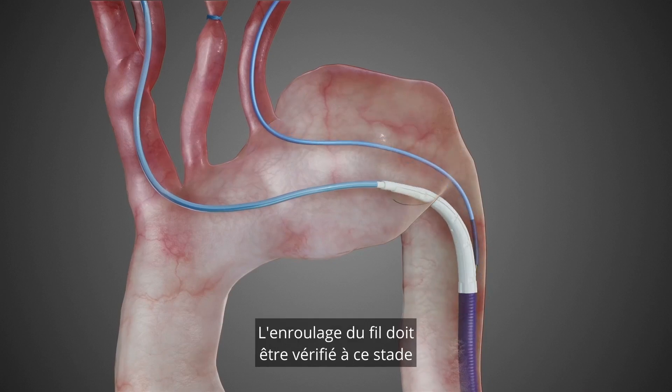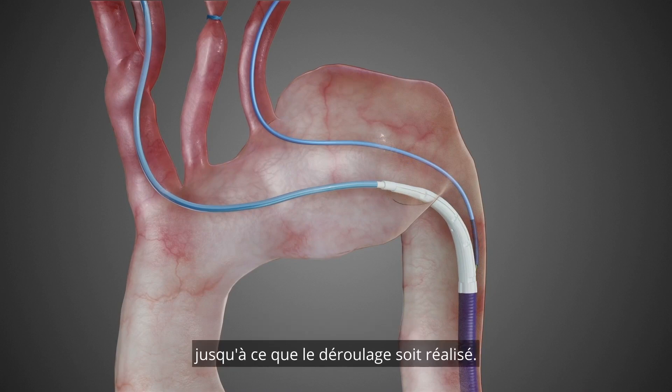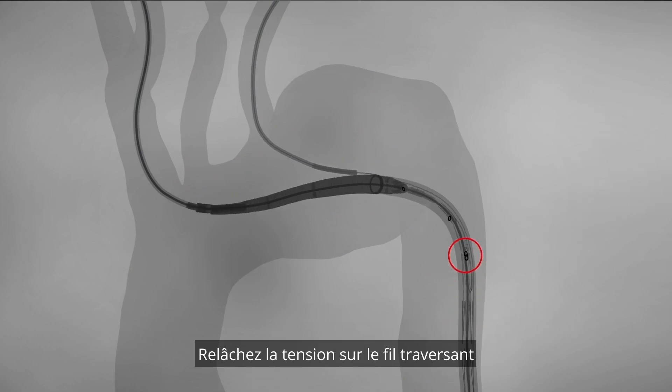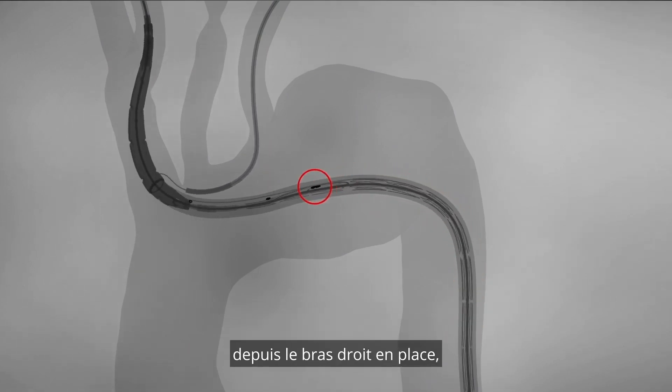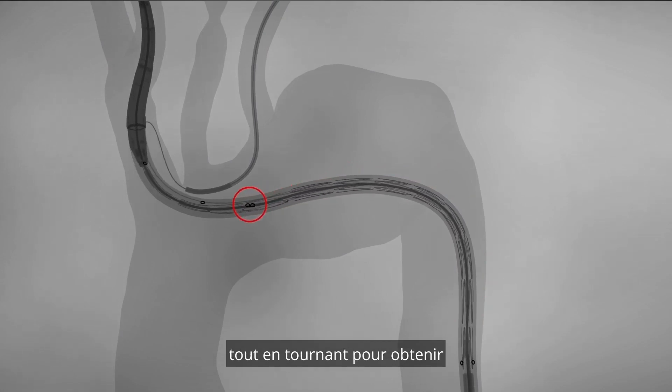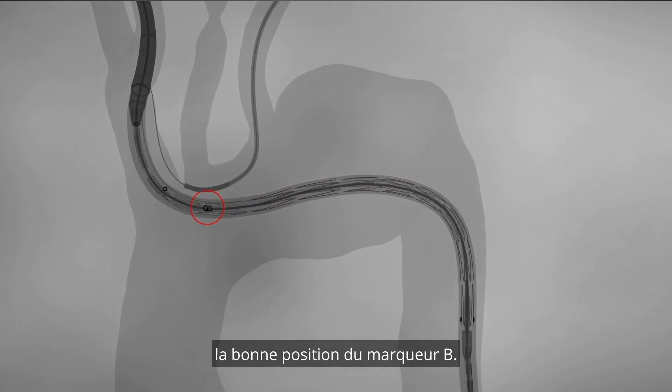Wire wrapping needs to be checked at this point in the descending aorta and if necessary rotate the system until unwrapping is achieved. Release traction on the through and through wire from the left, then continue by pulling the delivery system from the right arm into place while rotating to achieve the correct B marker position.